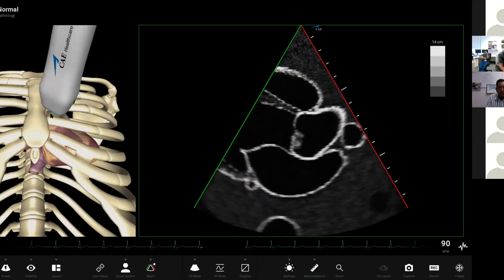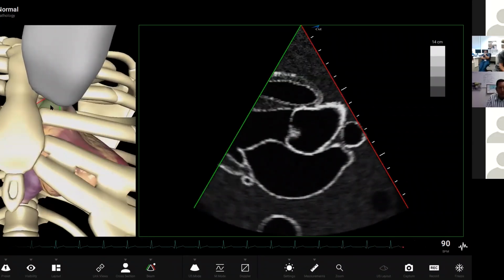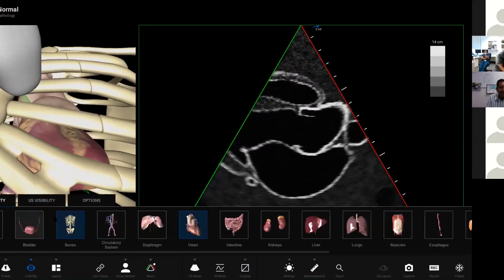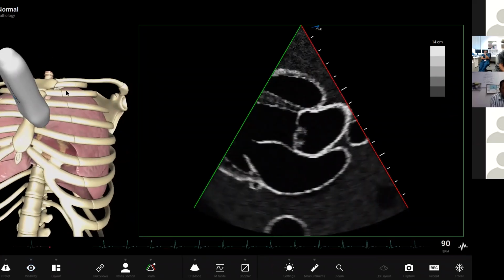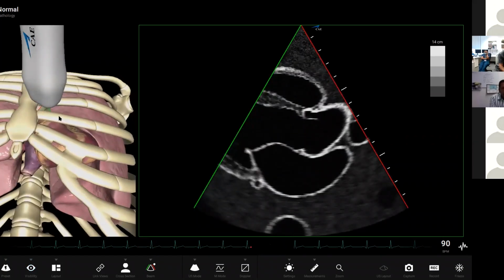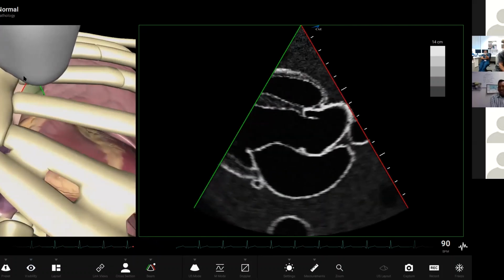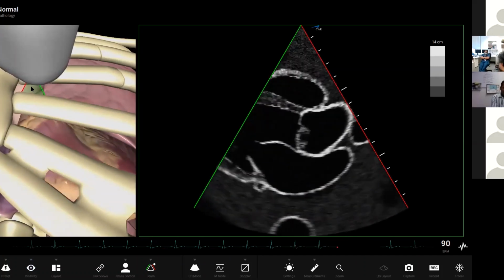Nice. Okay. So maybe I can do another simple tip and trick that you probably all know about, which is obviously the need to get right next door to the sternum. So in difficult to image patients with COPD or PEEP, we often have, maybe I'm cheating because I took the lungs off. So I just added the lungs back into the AR image here. And as you can see, if I can try and show it as best I can, we've got about a 20-cent piece, or if you're in the UK, a 20 pence piece size in there to try and image.